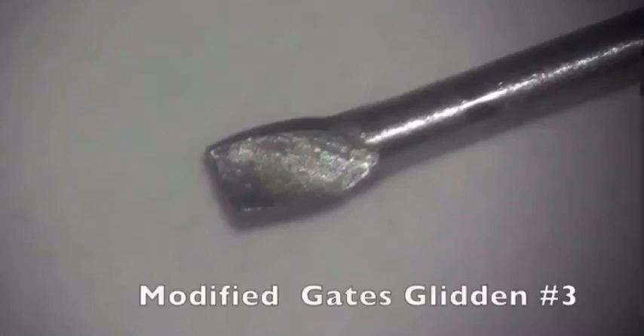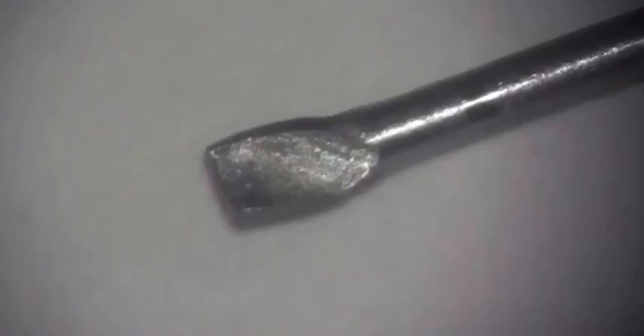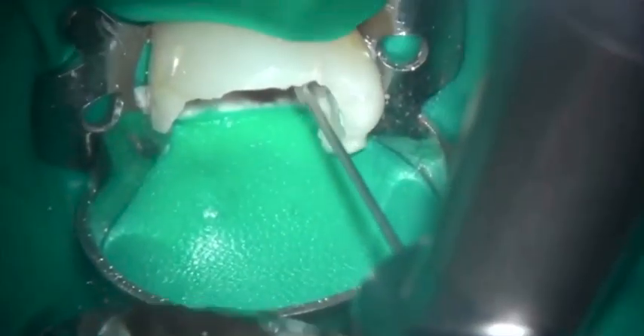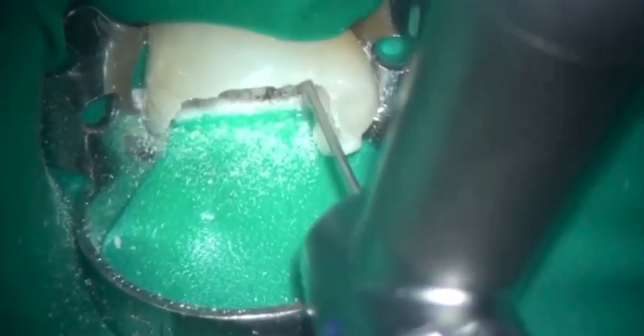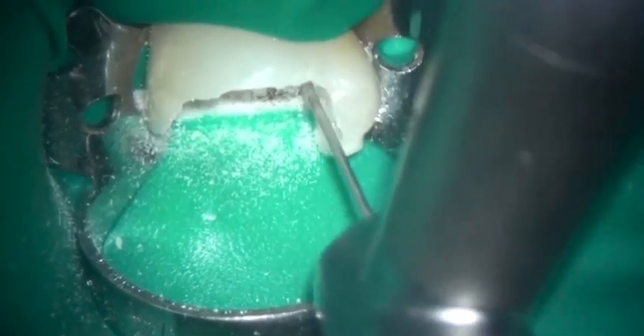The Gates Glidden bur can be easily modified by grinding off the bullet tip. It is then used to prepare the root canal down to the head of the instrument. In this case I'm using a little bit of lateral pressure because I could see on the CT scan that there was a curvature in a buccolingual direction. I want an unimpeded exit pathway or straight line access to the head of the instrument.